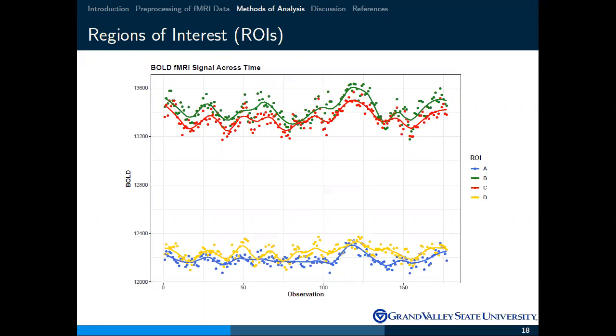So it's like a bigger parameter incorporating more values into its average than the yellow, red, and the green. But that's just what I've seen. Right. Yeah, that makes sense. What I'm describing would be like the correlation coefficient between them. But yeah, there could be other measures of association to relate the regions as well.